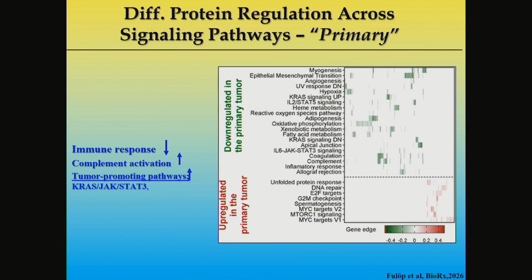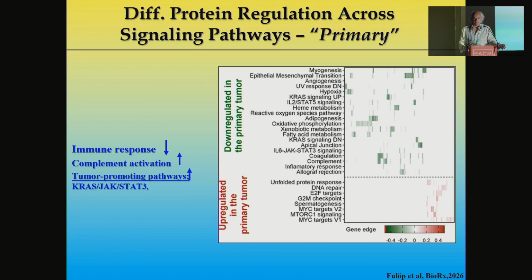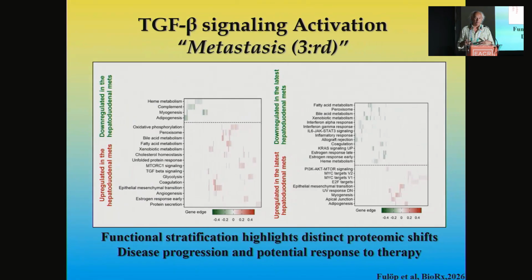So what you find here is a readout where you actually can see that there's a heavy mitochondrial activation that drives the metastasis, and also a very strong push in lowering the immune defense. So the tumor is doing everything to take over. And you will find activated pathways that we were figuring on how best to address in terms of treatment. And also then in the third metastasis, we also saw there's a shift.